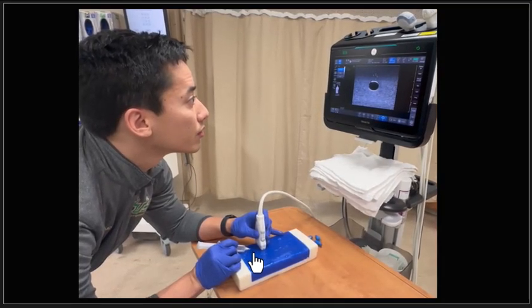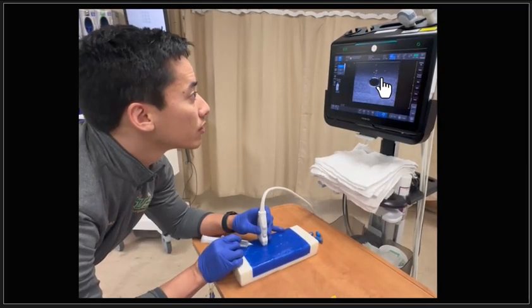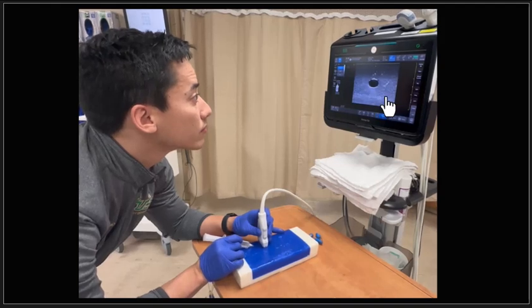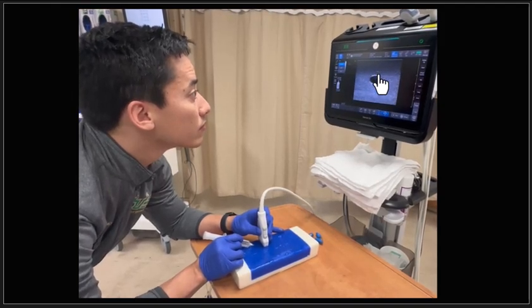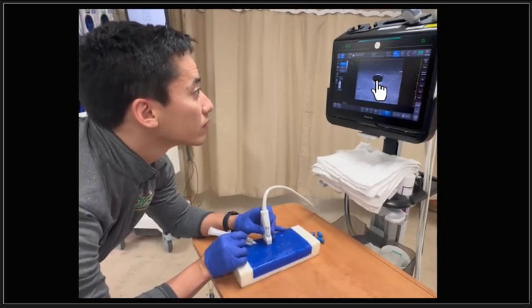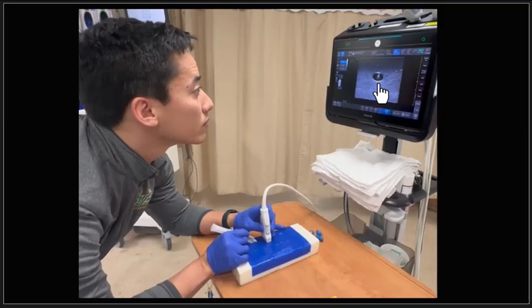So they're chasing each other. Probe hand slides forward, needle catches up. So the probe goes forward, then they find the needle in the soft tissue, and then they slide the probe away and then find the needle tip. So they're chasing each other down to make sure we watch that echogenic needle tip just as it's entering the vessel right there. You can see that nice little echogenic needle tip with ring down artifact. So that is the slide technique.